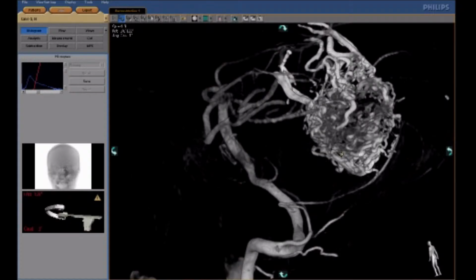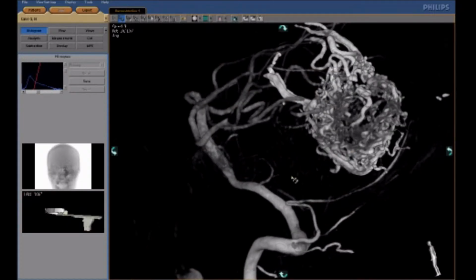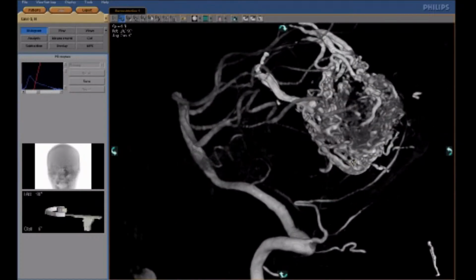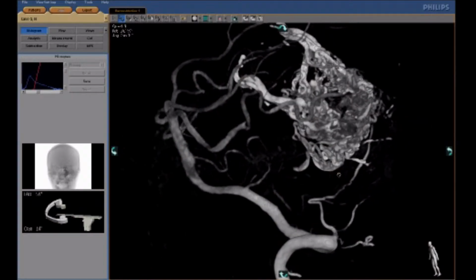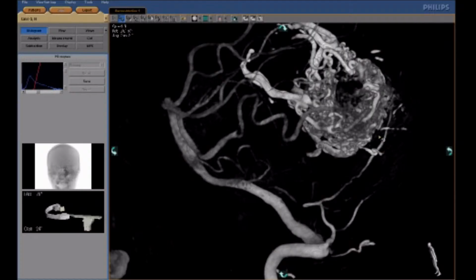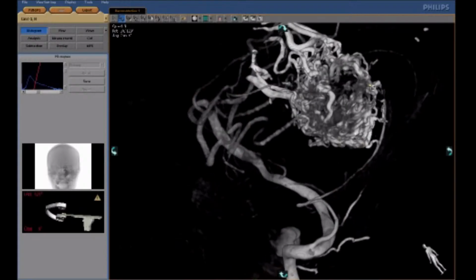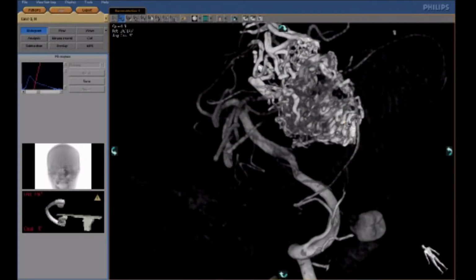I asked my assistant and colleague Rowan Maratlo to do the 3D angiography from the left vertebral artery, and you can see nicely there is a dural branch, the posterior meningeal artery, coming to the territory of the dural fistula.